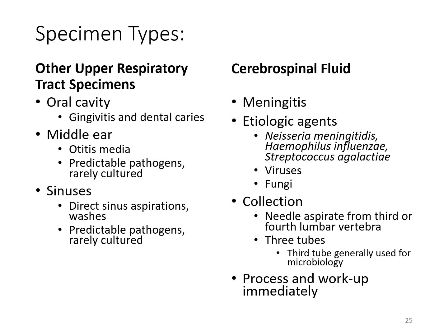But they usually are going to collect multiple tubes, and depending on the particular test that is being run will depend on which department gets which tube. But typically micro is going to get that last tube. That way you've got any potential for contamination out of the way.